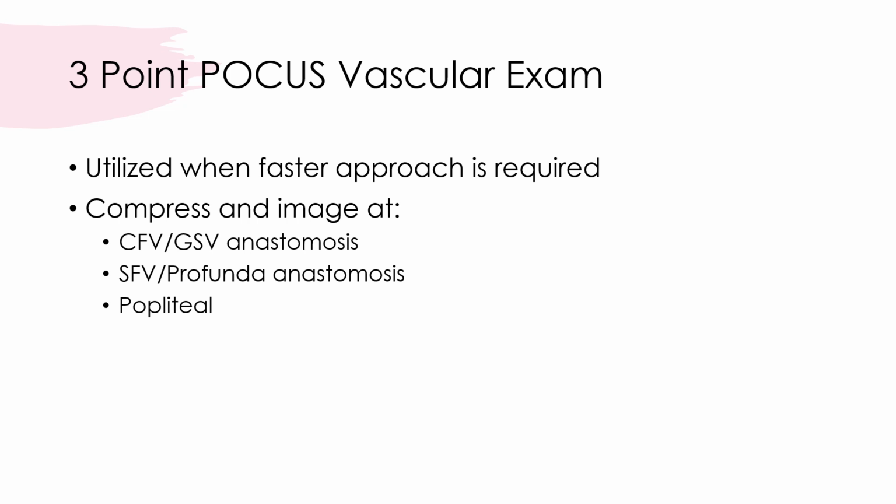So again, you're going to be as confident in the exam as you're confident in your pictures, and as thorough as you are in your images. So with this, it might work really, really well to make those really instantaneous decisions, with being a little bit more thorough and compressing the greater superficial femoral all the way down. That might give you a little higher level of confidence. So again, just 2 different approaches.